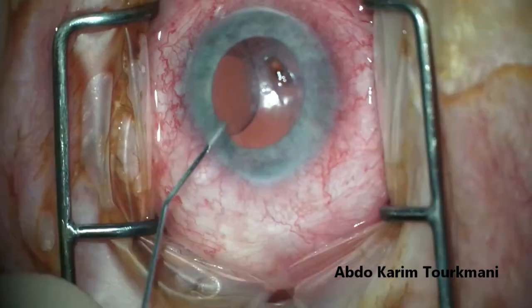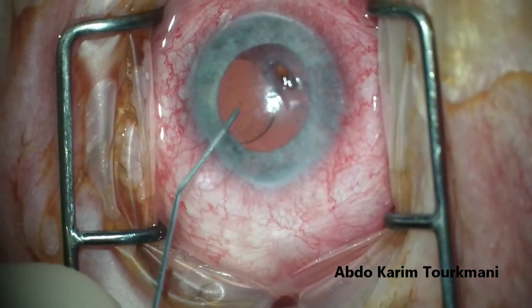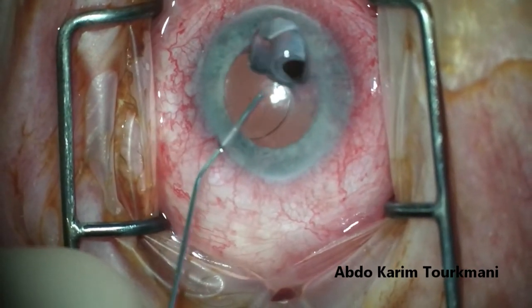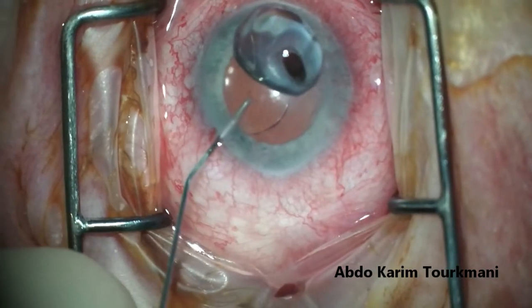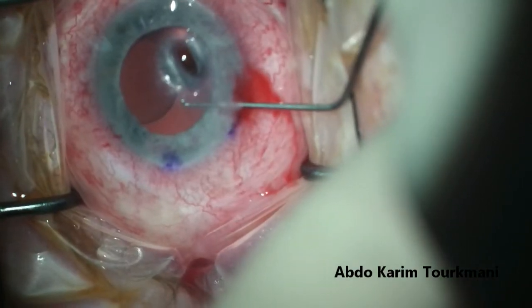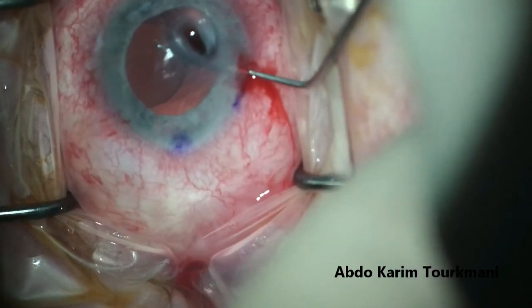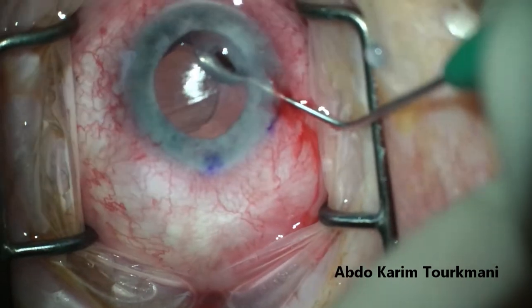One of our trainees performed a glue patch, but as you can see, the glue patch fell off, so I'm trying to reform the anterior chamber using viscoelastics. I have the feel that it was possibly the posterior capsule bulging under the lens towards the perforation plug in it rather than vitreous, but what I'm not so sure is whether behind the optic of the IOL there was still posterior capsule or not.